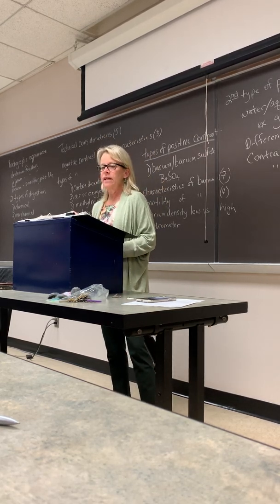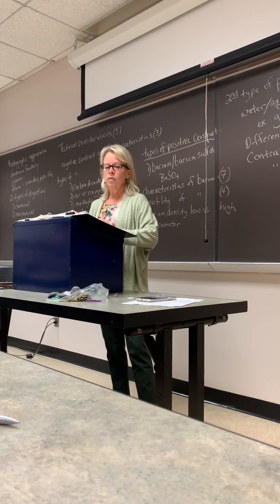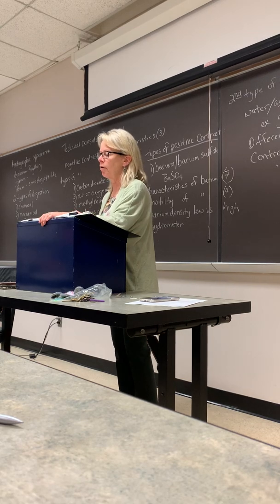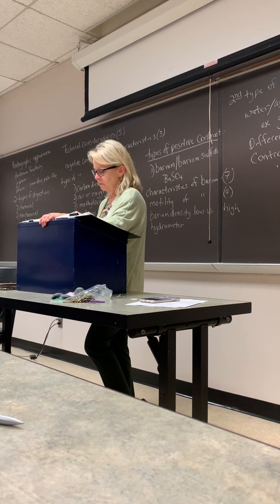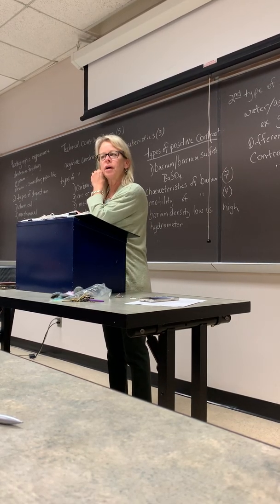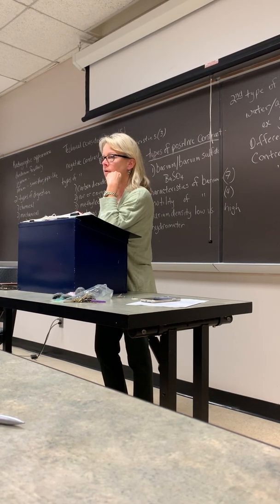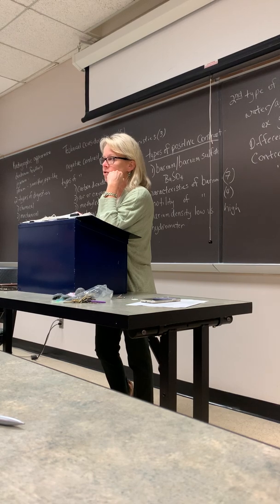All right, technical considerations. This is when you're radiographing the GI tract. What kind of equipment do we usually use when we x-ray the GI tract? Fluoro. So we usually need fluoro. A little bit of review for Terry's stuff. What's the maximum time on the fluoro timer? 5 minutes. Good. And what happens? The timer goes off and you get an audible sound, right? Does the machine shut off? No. After 5 minutes you get a sound, but the machine does not shut off.